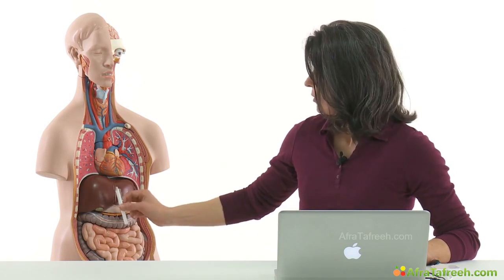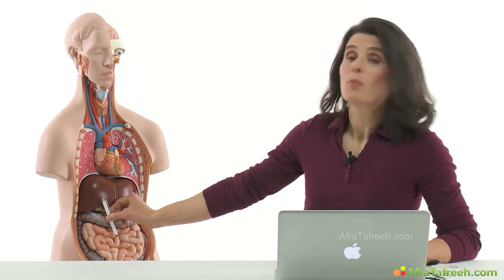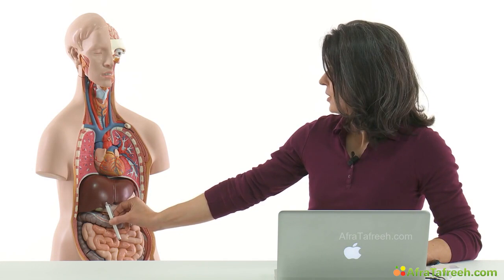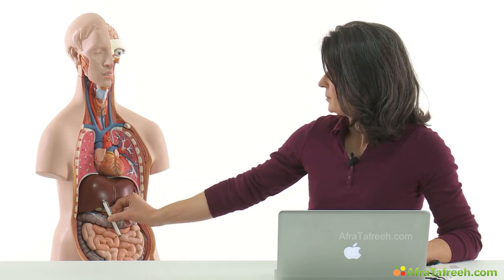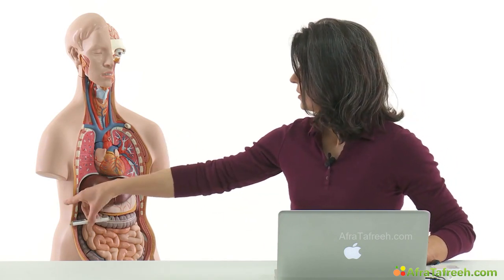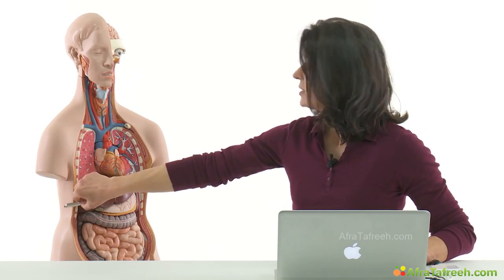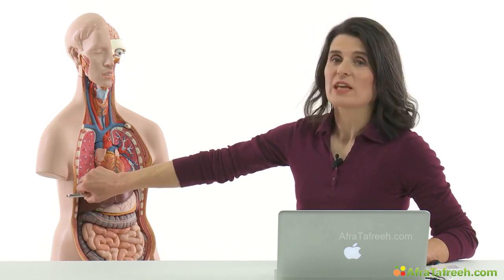And the next view will give us a good plane for assessing the hepatoduodenal ligament. This is the longitudinal portal vein view. Again, the transducer below the costal arch, but this time in an axis between shoulder and navel. And at last, we got the intercostal approach, where we place the transducer in between the ribs in an intercostal space, and can also tilt it upwards and downwards, and also change the intercostal space.